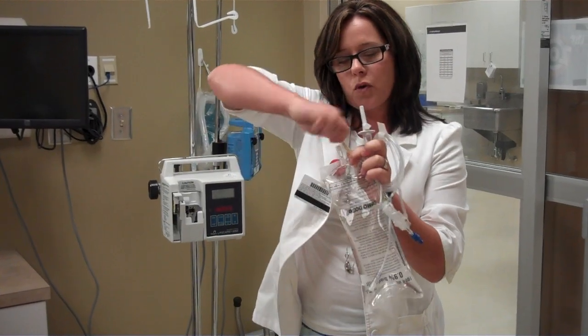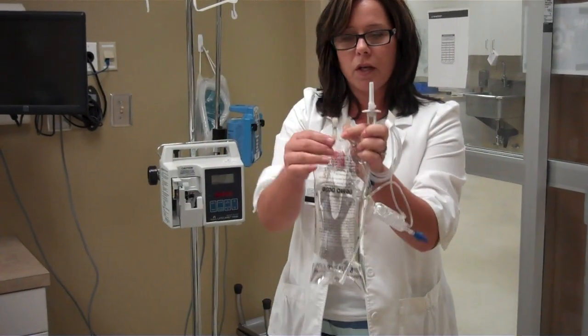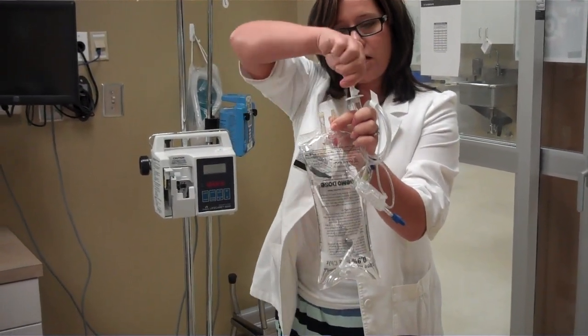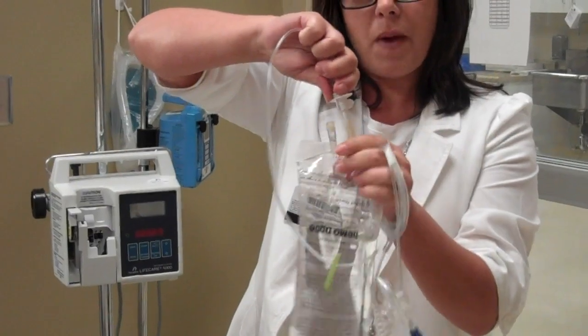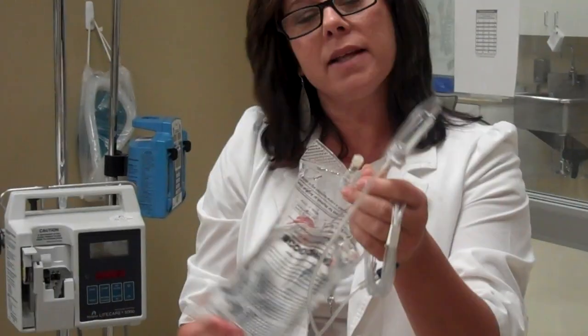You're going to pull the plug out of the IV fluid. You do not want to touch the part that you're going to spike, and also you don't want to touch this part. So you're going to spike the bag. Now when you spike the bag, nothing's going to happen — it's not going to prime all by itself.